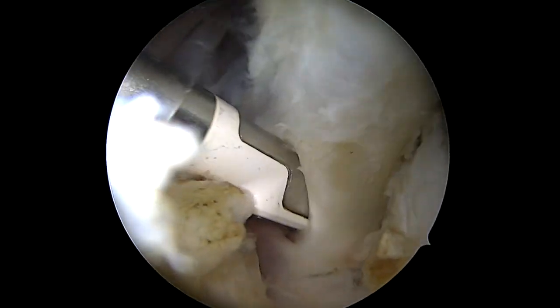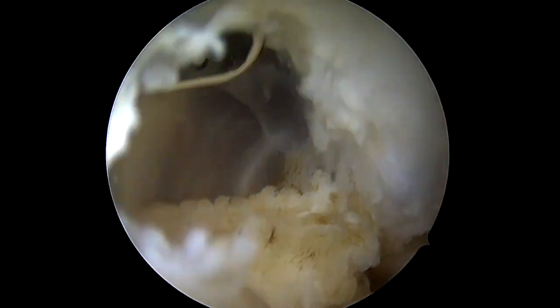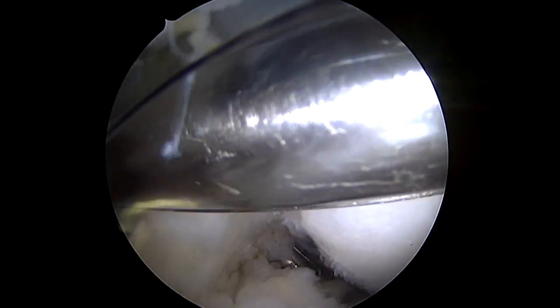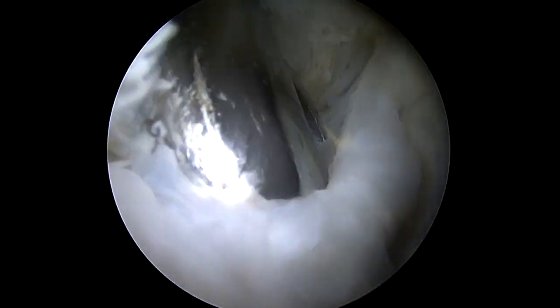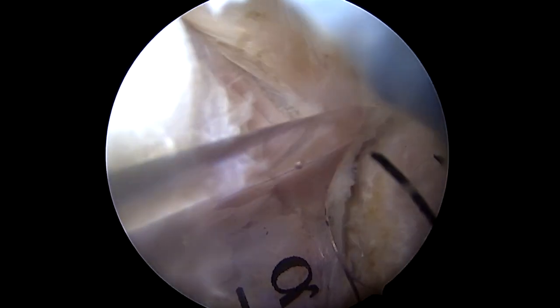That's where I need my screw to go. I'm going to clear the superior border of the subscapularis and the lateral border of the straps, then place a screw through the Halifax portal. To create the Halifax portal, a switching stick is brought from the back all the way out through the skin in front, then two half-pipe cannulas are introduced. This is the drill guide from the DePuy system, and we'll bring it down onto the piece to establish the correct screw trajectory.